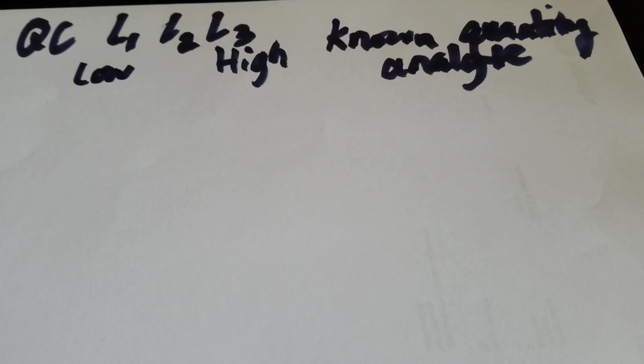Everyone, today we're talking about quality control, also known as QC, and how it is that we calculate it and why we do it. So QC is quality control, and it's measuring the quality of the process that's being done in order to create a laboratory result.